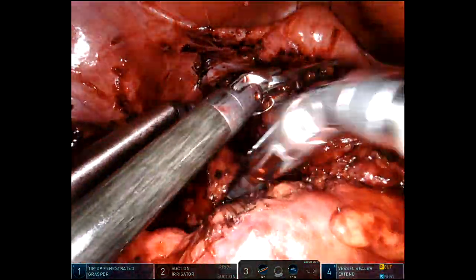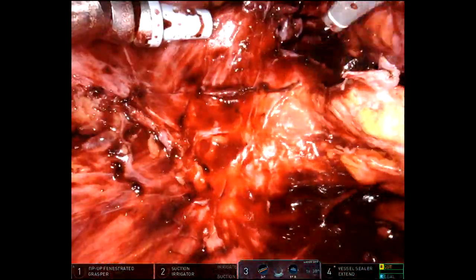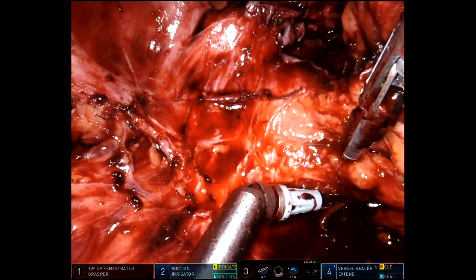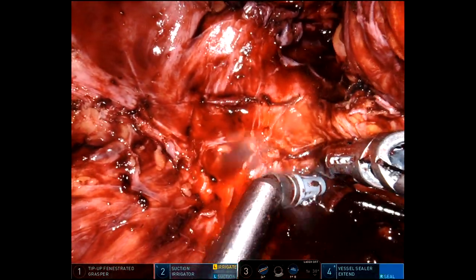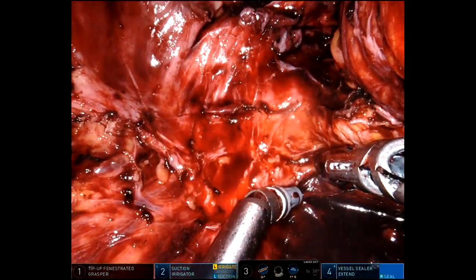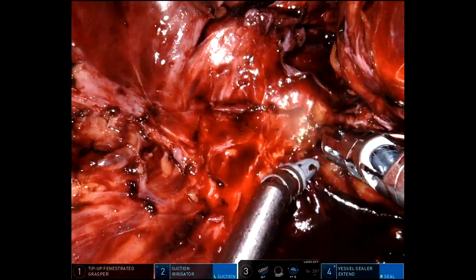There's a little bit of bleeding from the sidewall there. I just put a Surgicel on that for the remainder of the operation, and when I was done the bleeding had stopped.